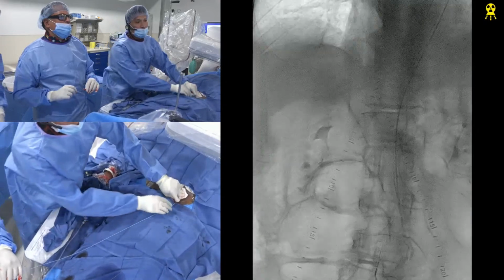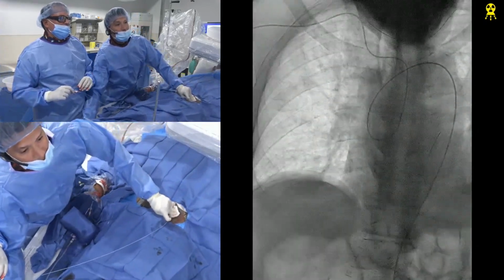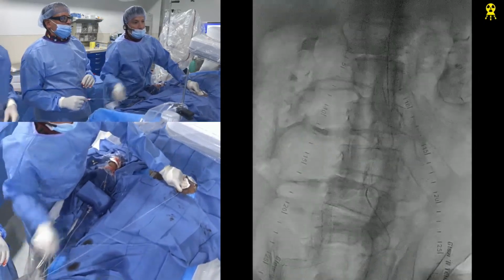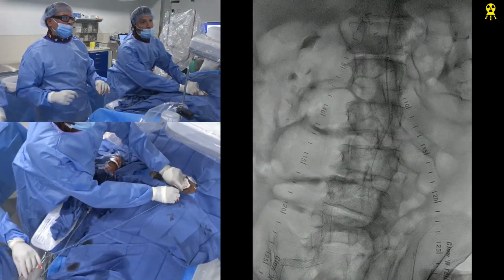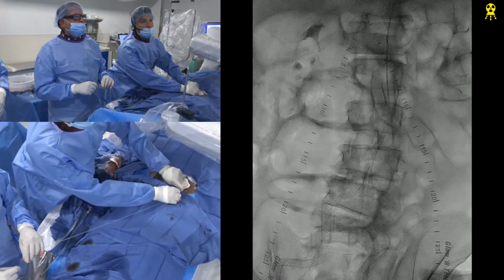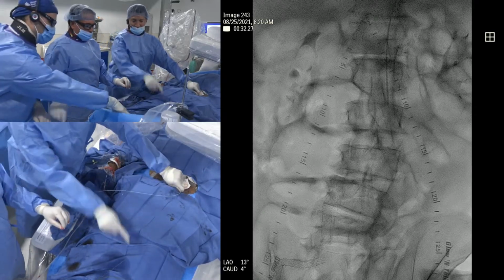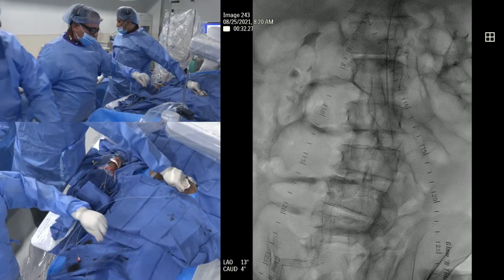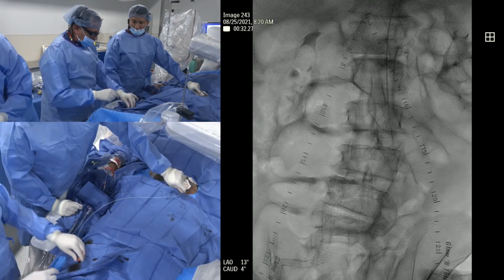Beautiful. Where's my wire? You have to still go up. Okay, it's way up. Okay, go now. Now you can go. So we're going to take this catheter up. Yep, there you go. Now we can turn it up. Let me get Supercore up. Yes, you're fine. Supercore is good. You're not going any further. Now we're going to put a 25 centimeter sheath. Yeah, we have 25 centimeter. Here you go. Okay.